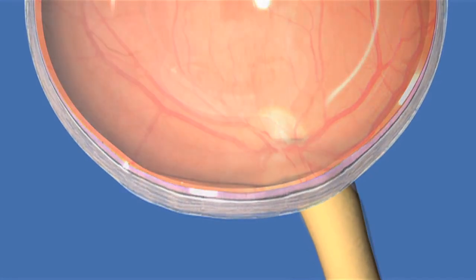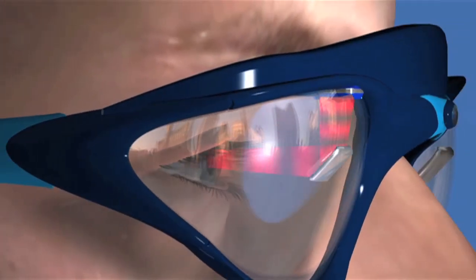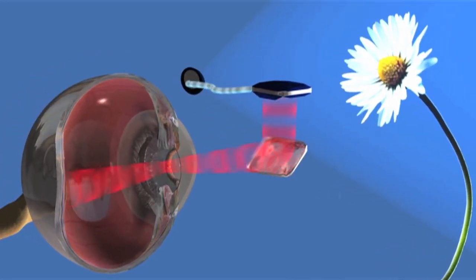And we came up with the idea of a photovoltaic approach, where the implant is a very simple photovoltaic array, no wires attached, just basically replacing photoreceptors with photovoltaic cells in a niche. And in a nutshell, everything else is done by goggles. So you wear video goggles, and information is delivered optically to the eye with a pulsed near-infrared light. All the implant does is convert pulsed light into pulsed current, and it stimulates neurons. This approach was developed because of my background in optics and ophthalmology. It was very natural for me to think along the lines of optical activation. And this is a very appealing approach to surgeons because the implantation is very simple. It's just injection into the subretinal space of some small modules of these arrays, and we can tile a large area by multiple modules, and everything else is done by goggles.